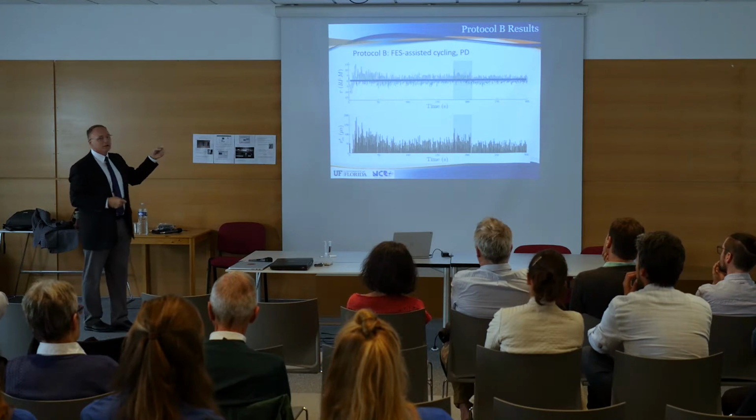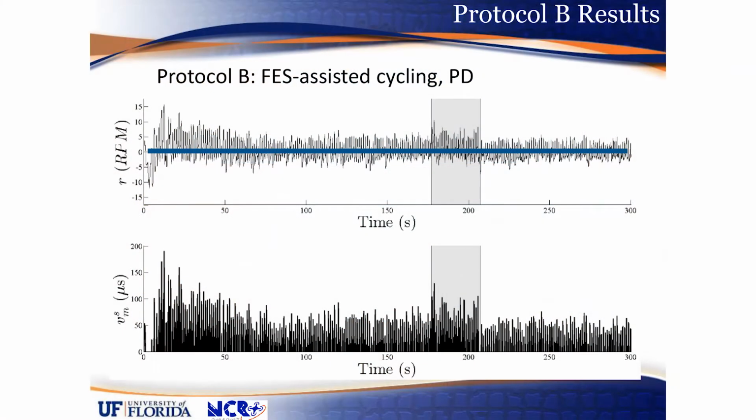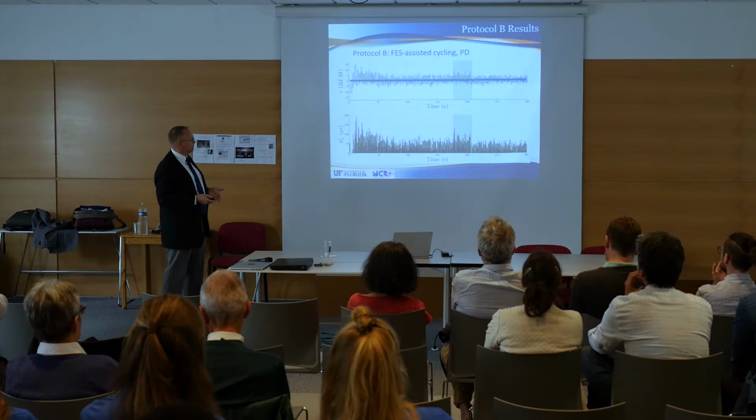For this individual in protocol B, because they weren't able to tolerate that level of stimulation, we actually showed them plots of this is the desired trajectory, this is your actual trajectory, and we asked them to try to pedal at this desired speed. So they were assisting here where FES was applied on top of that. And what you notice is there's no DC offset. The cycling is about 0. And when we added the extra resistance, there's more stimulation, but the errors are a little bit higher, but okay.